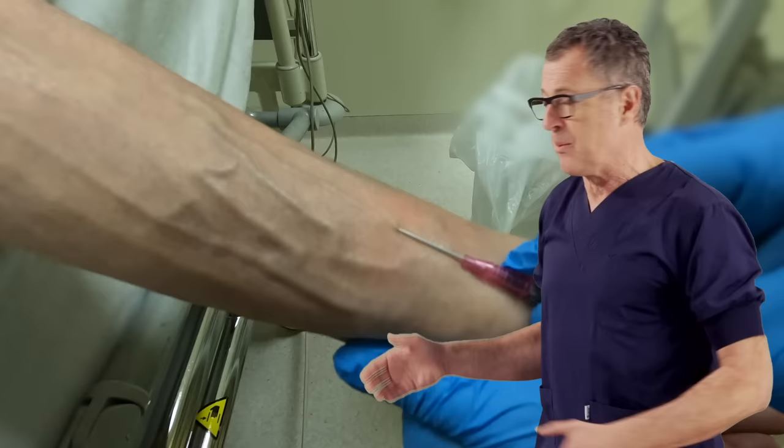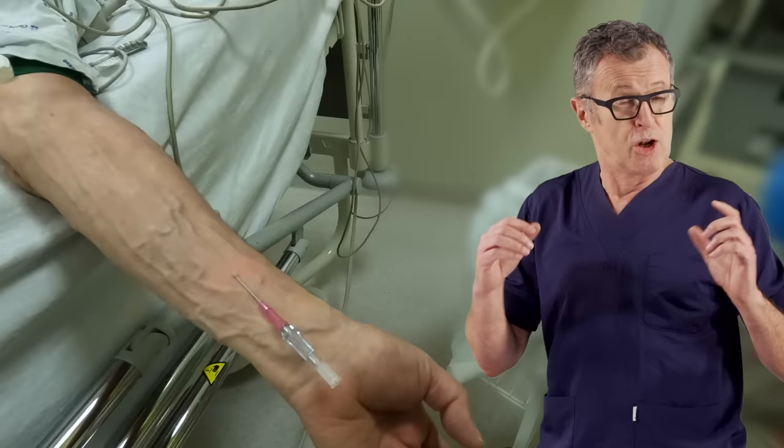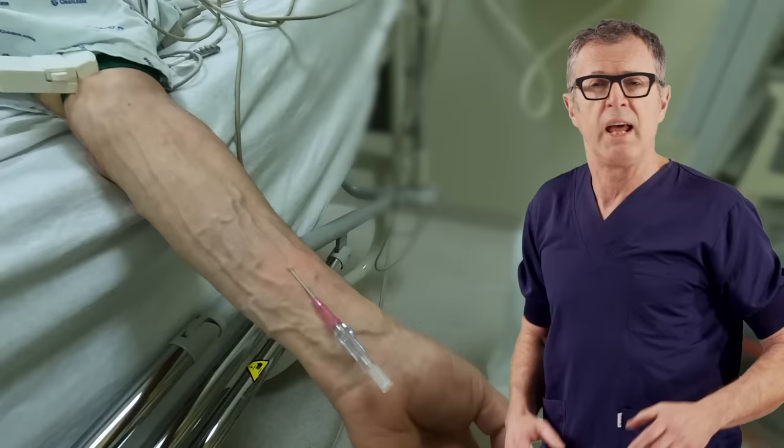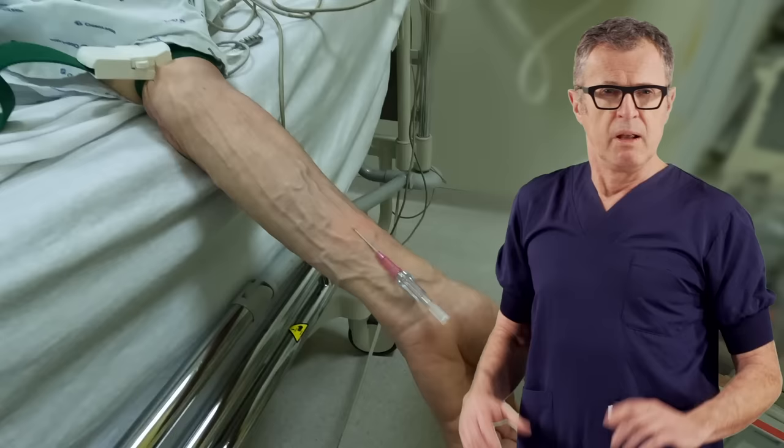Multiple needle re-entries without taking the needle out completely led to the failure. Looking at the needle hub, it appears the vein was not entered at all, but it would be wiser to leave the catheter in place since multiple attempts were made, in order to prevent hematoma formation. It's better to make another attempt with another needle while leaving the catheter in place. There appear to be multiple additional veins that could be good candidates for cannulation. Therefore, the wisdom: never rush to place an IV.